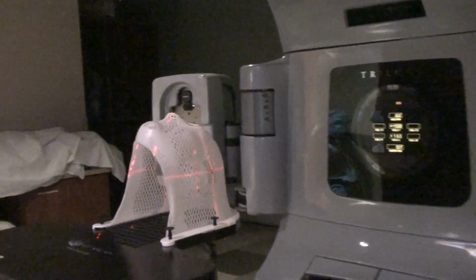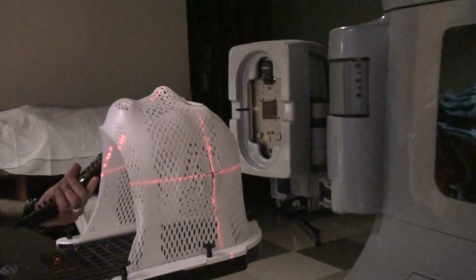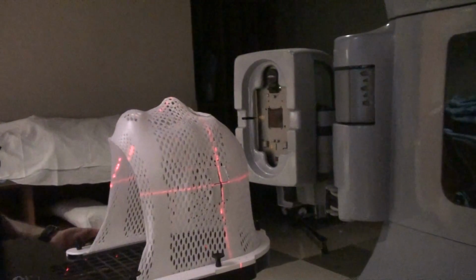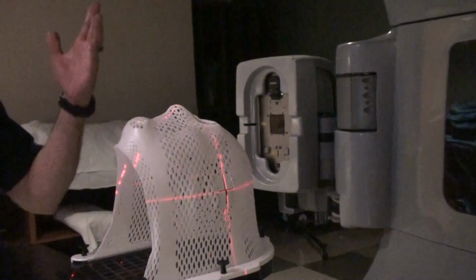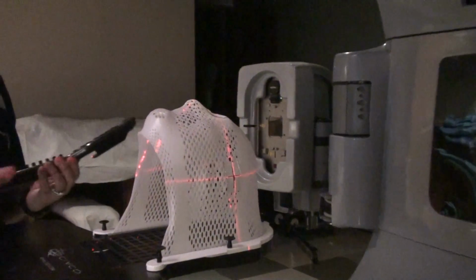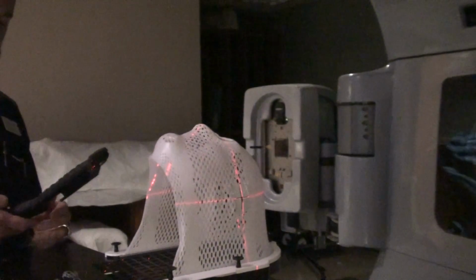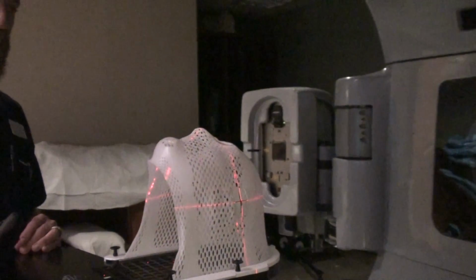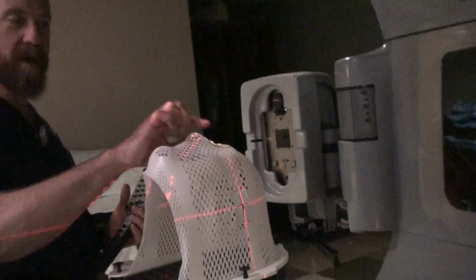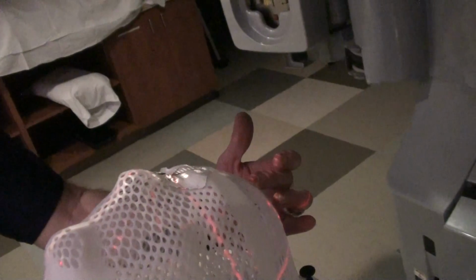So once you have your patient lined up, you'll then, well actually there's two ways to do it. You can line your patient up like this and then rotate the gantry over to the side, or you can start off on a lateral using the crosshairs from the collimator and the opposite laser. Any way you get it lined up, it's fine, depending on what your facility likes to do. You will usually, if you've got a good simulator person, have an anterior mark as well. That anterior mark is going to give you your left-right positioning.